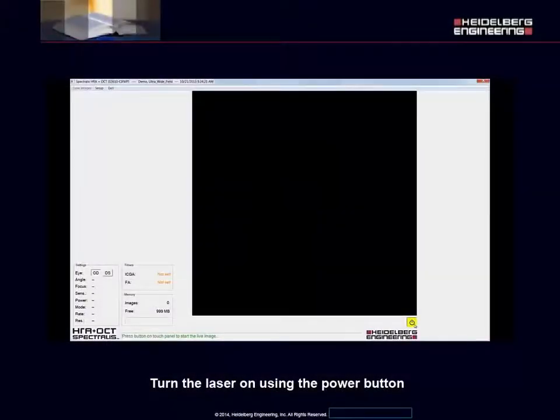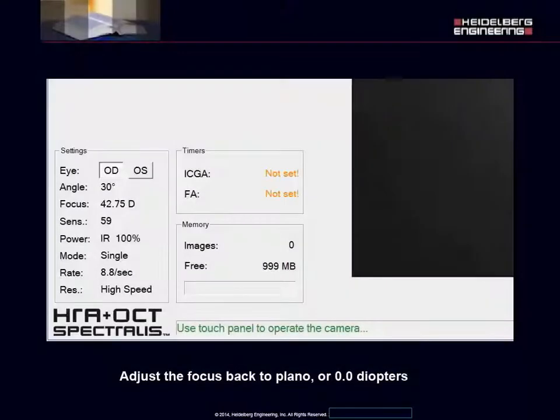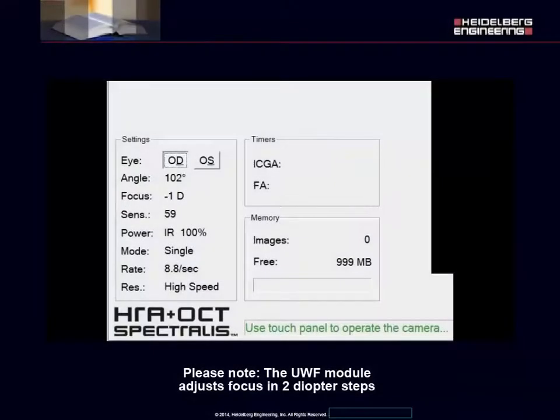Turn the laser on using the power button. Adjust the focus back to plano or zero diopters. Please note, the ultra-wide field module adjusts focus in two diopter steps.